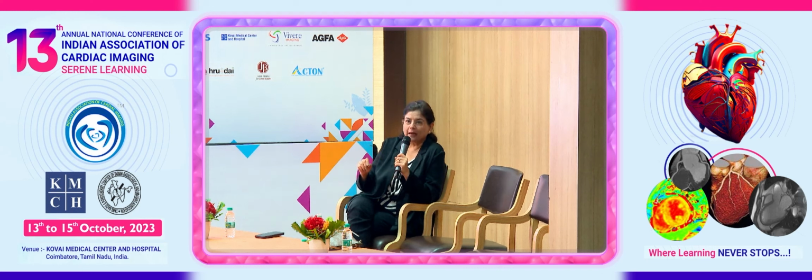What invariably happens is that one set of images goes to the person who takes it to the vendor. He comes back, gives you the answers to all the questions, gives you the report, and a lot of cardiologists in India are unfortunately following that number and using the valve. And then this whole gamut comes out, which Sandeep has just highlighted from A to Z, that everything doesn't go right.